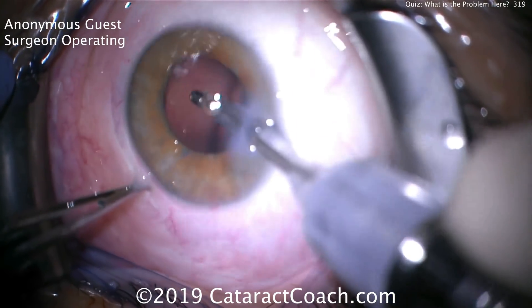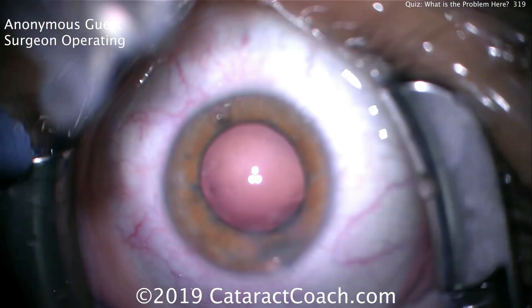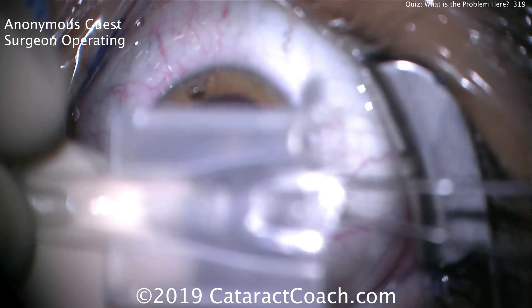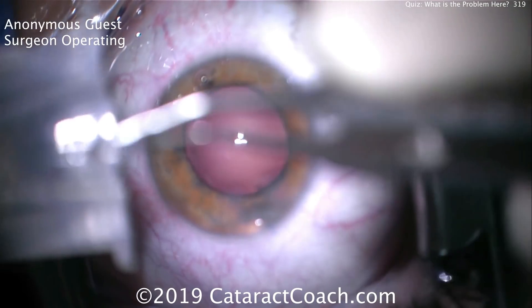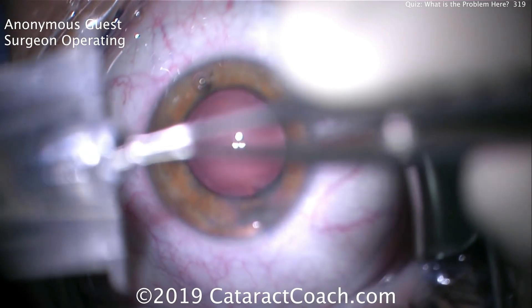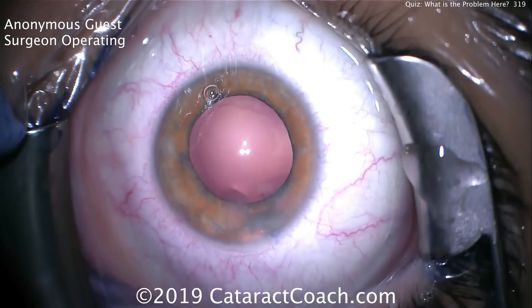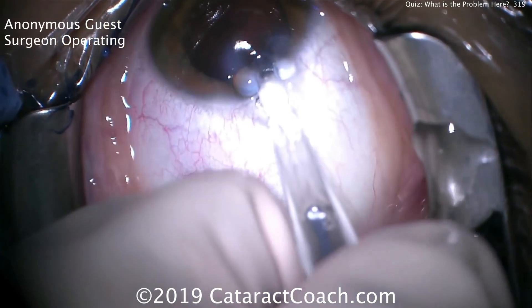Cortex removal goes smoothly. The pupil comes down a little bit in this patient, and that's okay. Now the capsule bag is filled with viscoelastic. Here's the IOL being placed in the injector — a little bit out of focus, but that's okay. The IOL is going to be completely placed in there; the surgeon is loading the lens. This is an anonymous video that was submitted. And now it's time for IOL insertion — so watch carefully here.